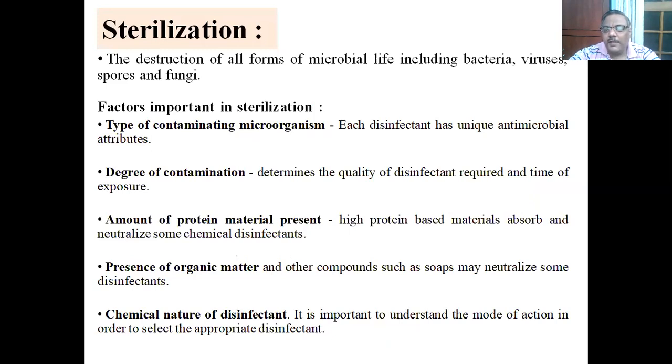The term that we are concerned with today is sterilization. Sterilization, like in cleaning, I said that it's removal of the microorganism from the surface. But sterilization is a complete destruction of the microbial life, including bacteria, viruses, spores, and fungi. Before going for the strategies that we have for gas sterilization, we should know the factors that will influence our sterilization.